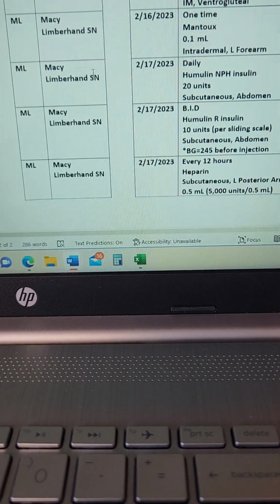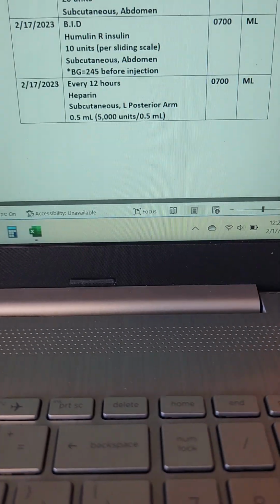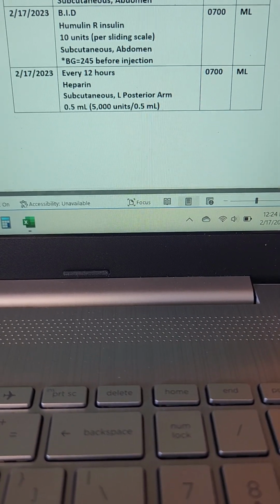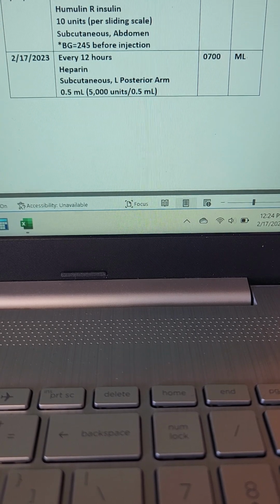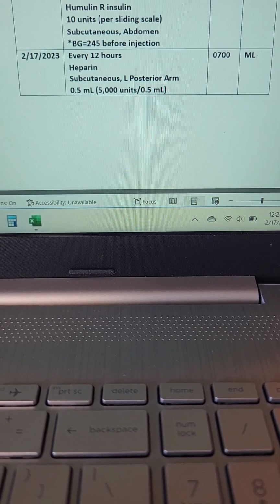Okay, next thing I would do is I would go to my medication administration record. And as you can see, I've already documented that that is my name. Administered heparin, 5,000 units, which would be 0.5 milliliters, the time, the date, and my initials.